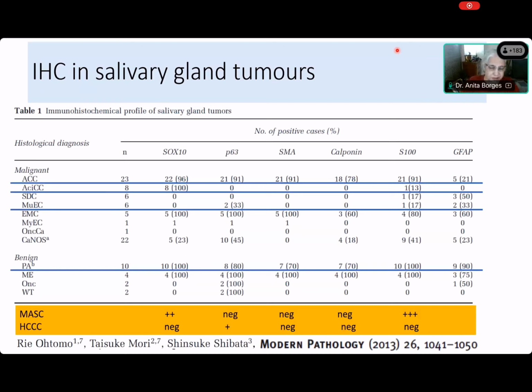I just showed you this because it's the same thing all over again, except that the tumors are on the y-axis and the different markers are on the x-axis. And then I just added two things over here. This is mammary analog secretory carcinoma, and the new classification just calls it secretory carcinoma. Yes, it expresses SOX10. And this hyalinizing clear cell carcinoma, now just called clear cell carcinoma, does not. It's exactly the opposite when you talk about P63. P63 is not expressed in the secretory carcinoma, but it is expressed in the clear cell carcinoma.